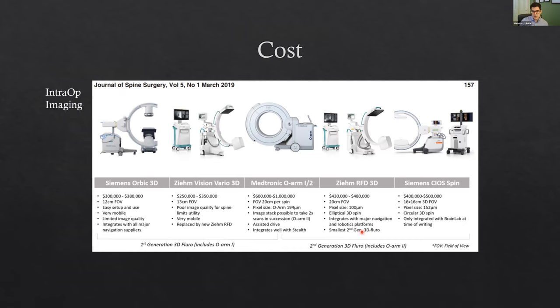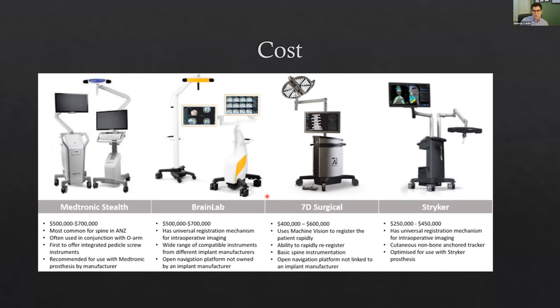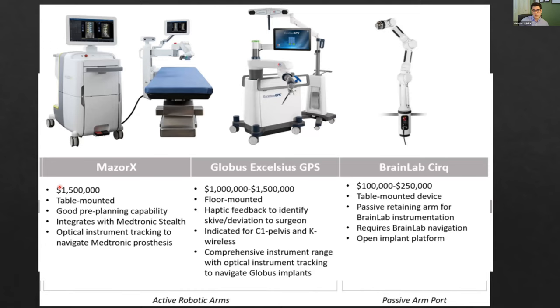Cost, again, globally. Even for the U.S., a fully developed and very wealthy nation, this is very expensive. And this is just the first part, right? It's just the imaging acquisition. Let's take the Siemens or the Medtronic arm, let's say $500,000, and then you need the navigation system, another $500,000, and then you're going to add robotics, which is 1.5 million. So from the get-go, before you've placed your first screw, you're talking about between $2 and $2.5 million of investment. To me, this is one of the bigger barriers in adopting all this new technology. The cost is so high that it's very difficult to bring this technology.